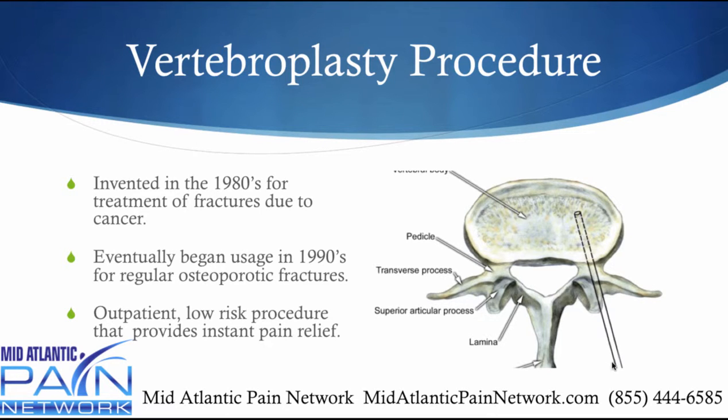What you'll have is a catheter going through this bone here called the pedicle. This is the spinal canal. You want to avoid that. It goes in, you get into the fracture, and you squirt in cement. Okay? And a lot of people will go on both sides, called bilaterally.